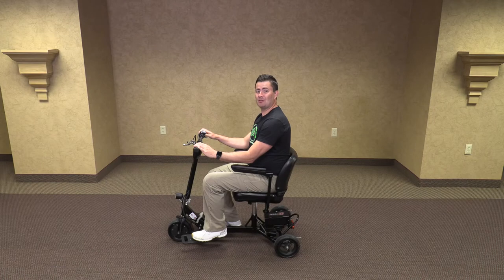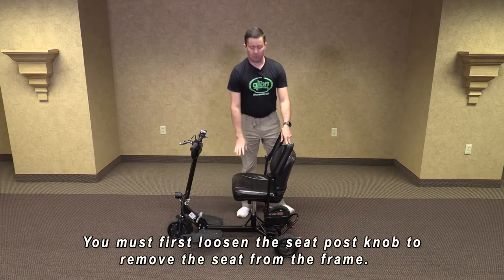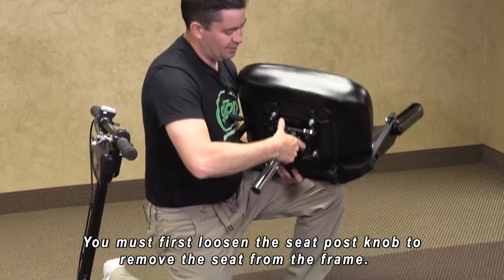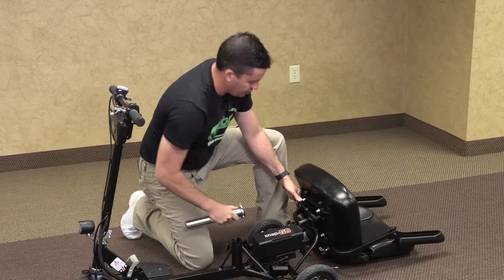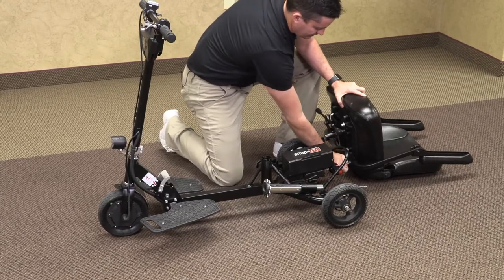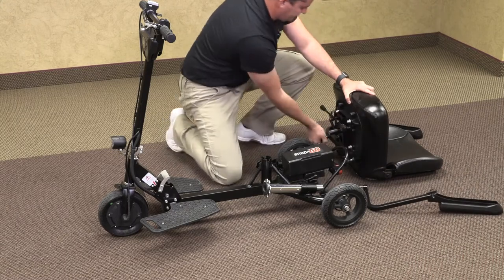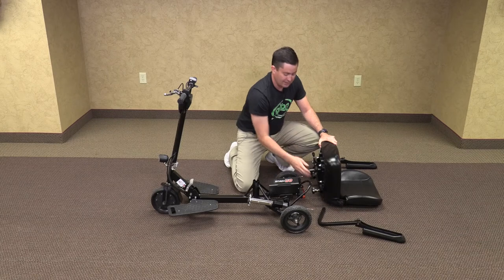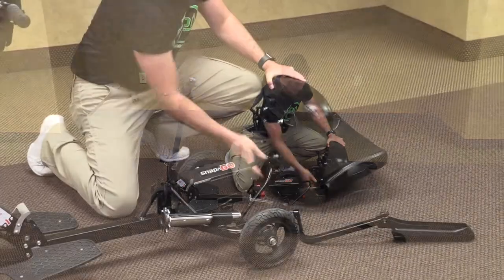Now we are going to fold up your Glyon Snap and Go Model 335. First we are going to remove the seat, lift it up, and remove the seat post. The adjustable handle may need to move forward and it slides right off. We will slide it into its carrying position. Then we will remove our armrests. I do tighten these nuts back up when traveling to make sure they don't accidentally vibrate out as you are moving around.